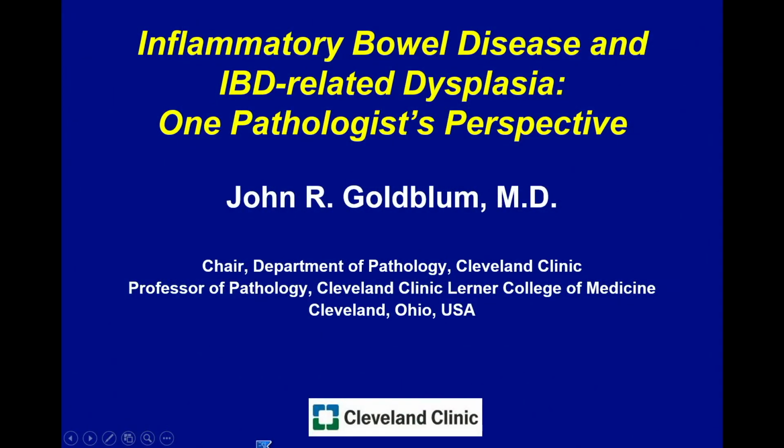So we see an awful lot of this. Okay, this is the quiz. Take a look at this colectomy specimen. Anybody want to give a diagnosis? This is not a trick question, I swear. I heard Crohn's. UC. Okay, well, so if you look at this, you can't quite tell down here, but this looks diseased. It looks like continuous disease all the way around. Pretty abrupt stop right there, and this all pretty much looks normal. Would you, for the most part, agree with that?